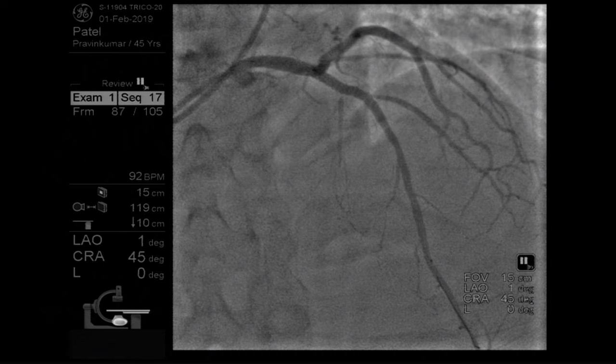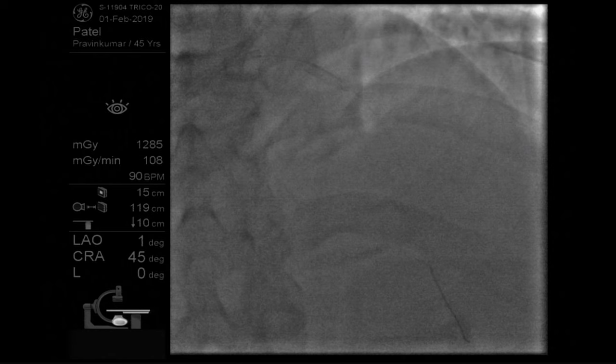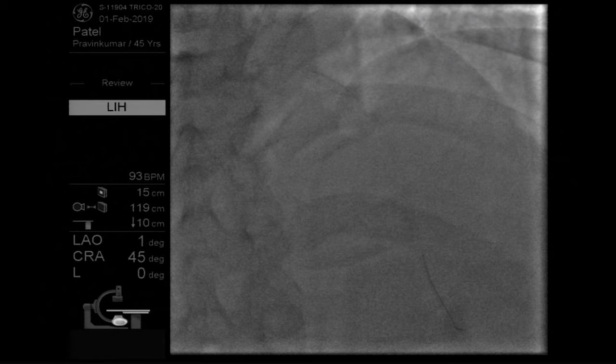Dr. Akasaka, do you think for ISR cases it is mandatory to do imaging before putting any further stent or balloon? Yes, it depends on the institution, but in our institution, we always measure the size of the balloon and the stent based on the OCT findings, because the measurement is very accurate, and the longitudinal measurement is also very accurate.